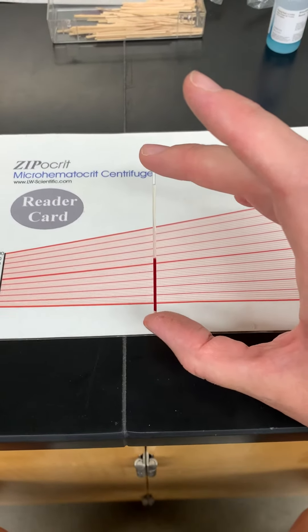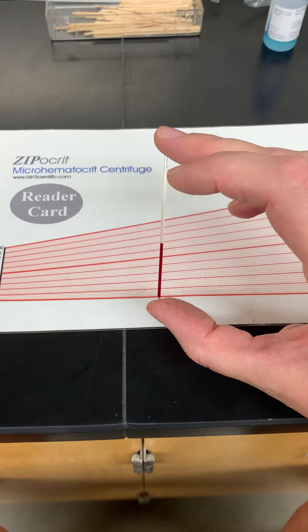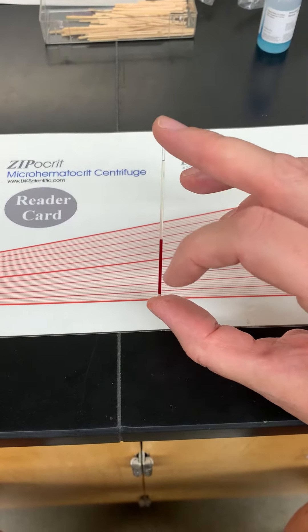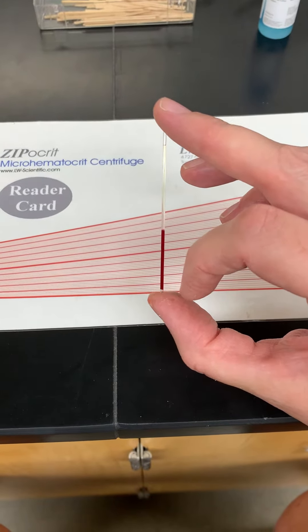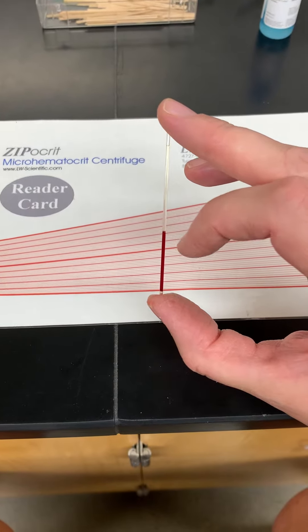How do you do a hematocrit? You take a capillary tube, fill it with blood, or pull up blood until it's almost full. Then you cap the bottom with clay, stick it in the centrifuge with the clay side out, spin it down, and the red blood cells will be packed at the bottom of the capillary tube.